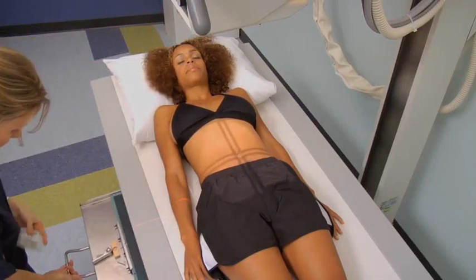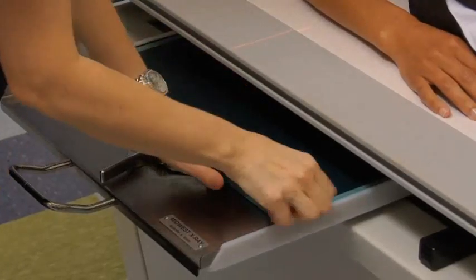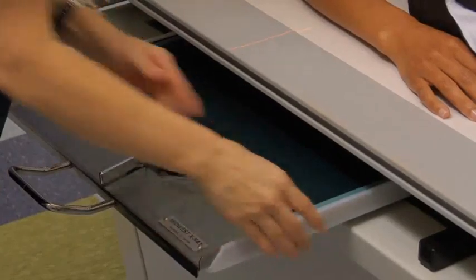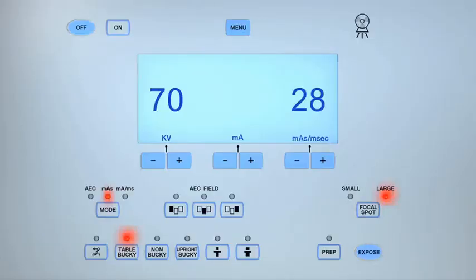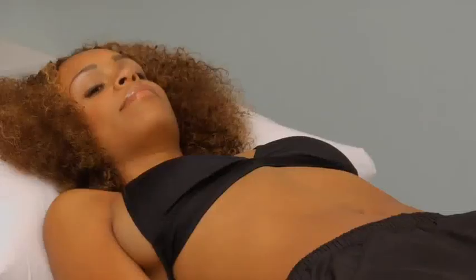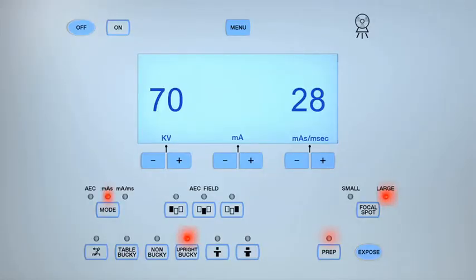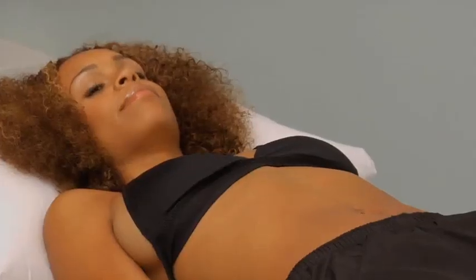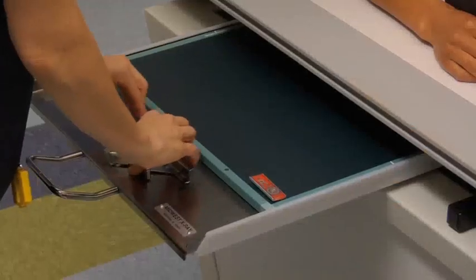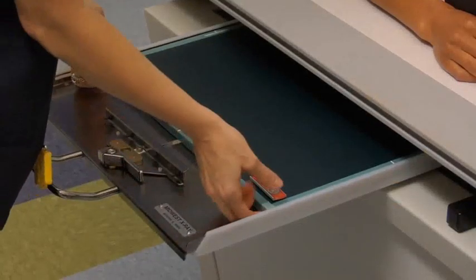Position the lead marker within the collimated light field, then move behind the lead barrier. Check that the exposure technique is appropriate for the patient's body habitus and make any necessary adjustments. Ask the patient to breathe in, then out, and then to stop breathing. Expose the cassette and then tell the patient that they may relax and breathe normally. Remove and process the cassette.